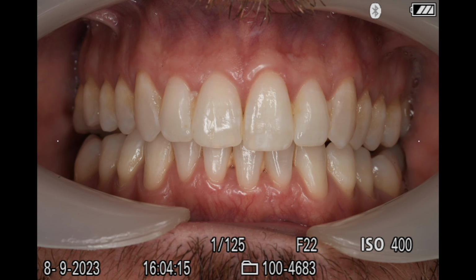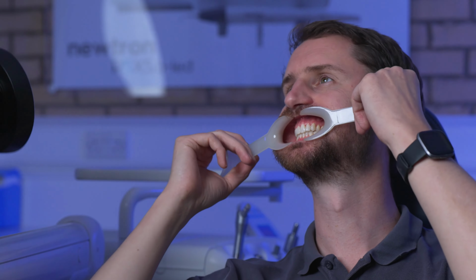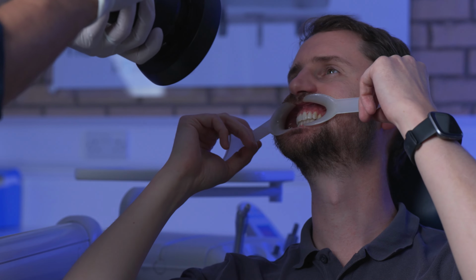If you are photographing the patient in a dental chair, which is often more difficult than having them sat up, you may want to raise or lower the chair and then ask the patient to turn their head towards you to avoid you leaning over and putting your back at risk. You then rotate your body to face the patient and rotate the camera to the same angle as the occlusal line.